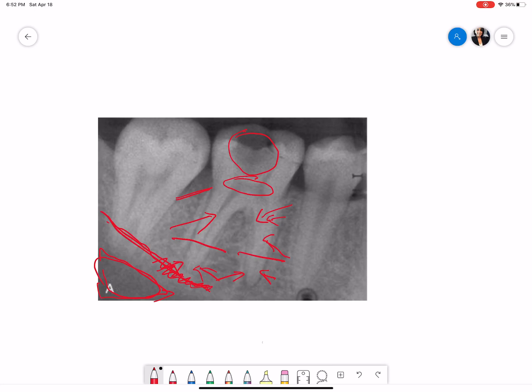This could be the mylohyoid ridge, which always runs parallel to the inferior alveolar nerve canal. We don't see any image of the canal here, but this shadow appears to be the submandibular gland fossa.